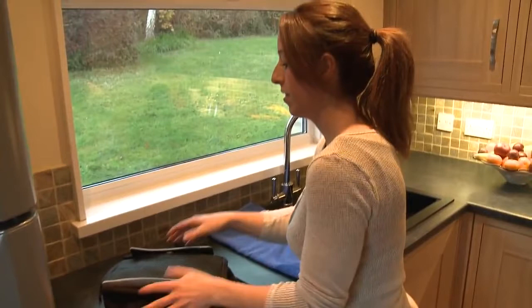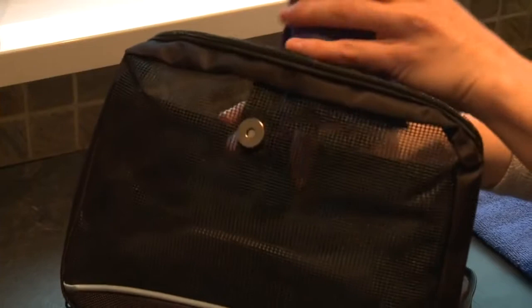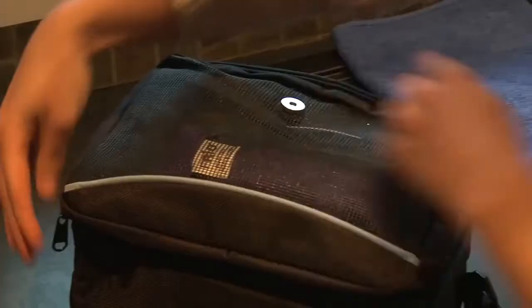The Frio Vitesse Medical Holdall is perfect for carrying any size of Frio Wallet in the front meshed pocket, allowing air to circulate, ensuring the wallet is able to breathe, aiding the evaporation process.